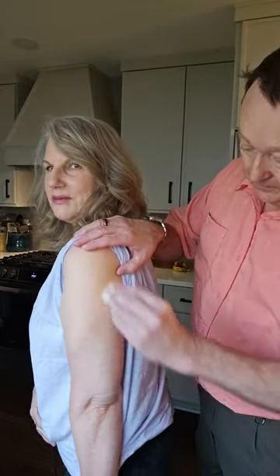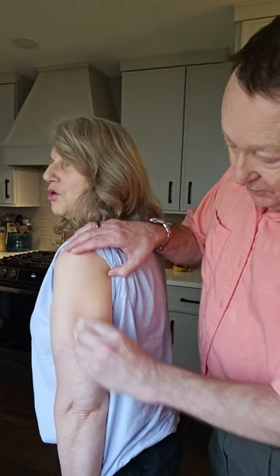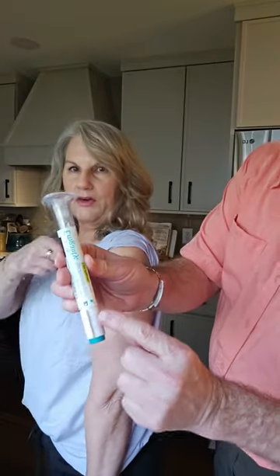We decided to switch sides. So we're going to do this side. So cleaning the area. Back of the arm. Where you will apply the injection. Where the subcutaneous tissue is. You're going to let that dry. Okay, go ahead and show the buttons.